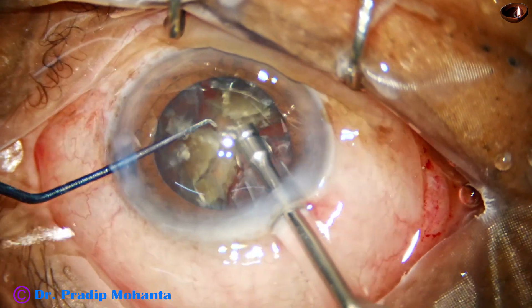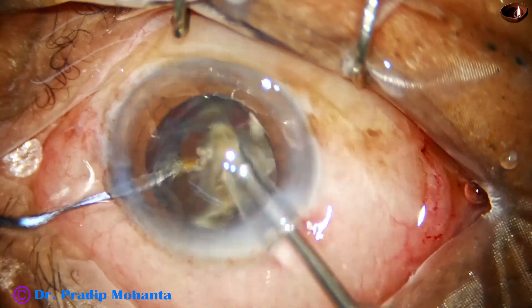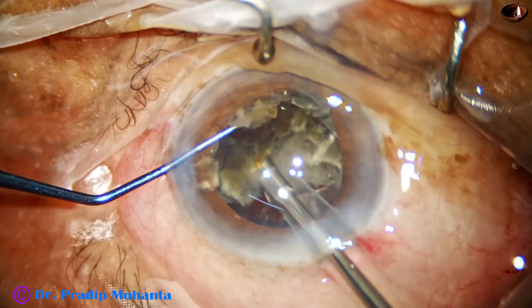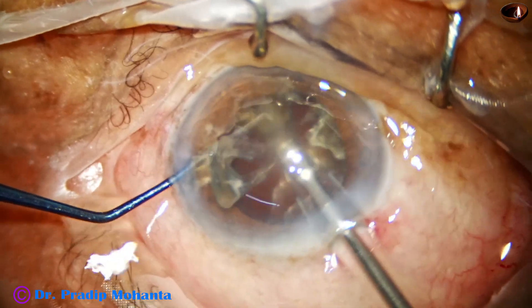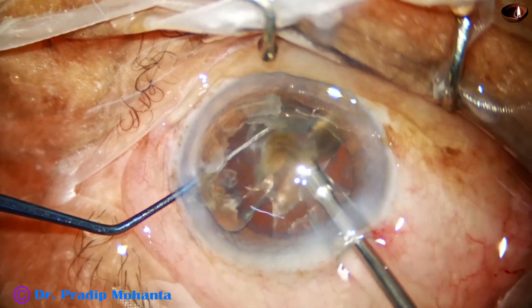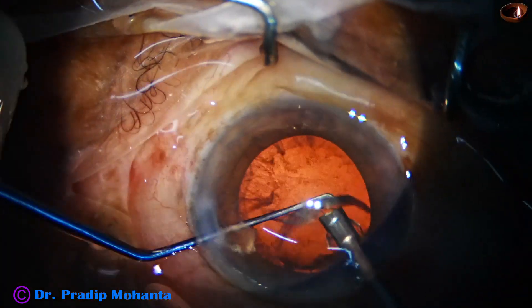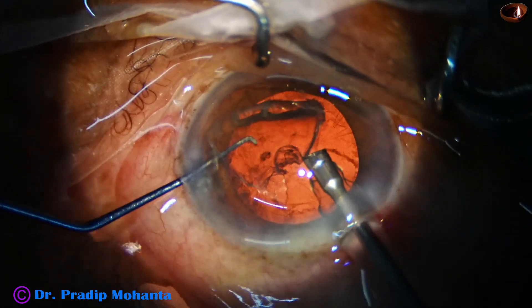Nowadays in hard cataracts I am detaching the epinucleus and emulsifying the hard nucleus first. The epinuclear shell is acting like a contact lens and protecting the posterior capsule — I call it the contact lens concept. A protective lens to protect the posterior capsule, and that lens is the epinuclear shell. This is the epinuclear shell of the previous hemi-nucleus.